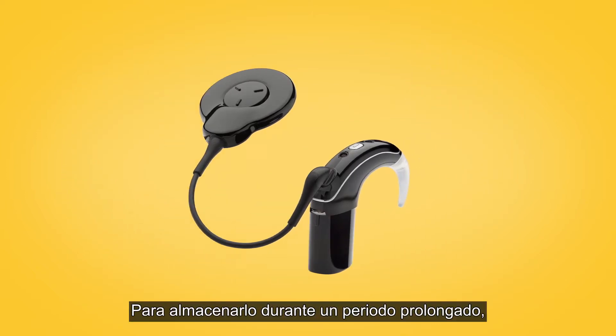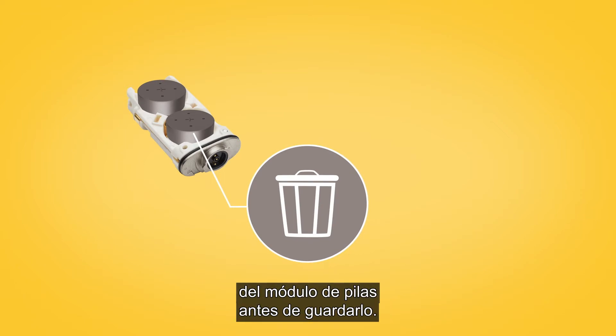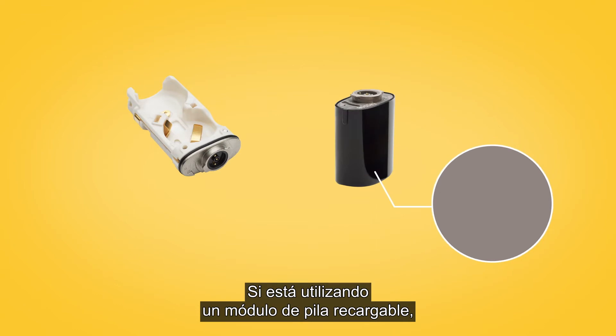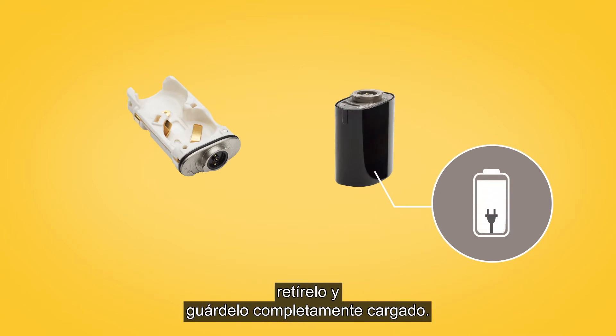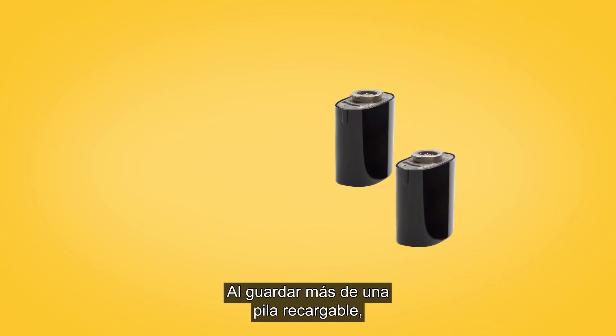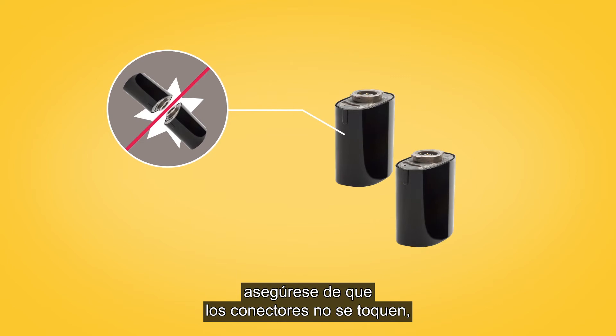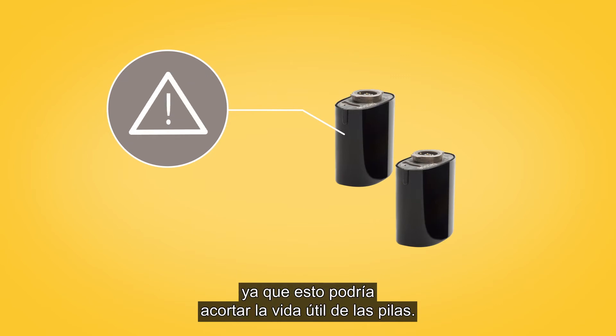For long term storage, you should remove disposable batteries from the battery module before storage. If you are using a rechargeable battery module, remove it and store fully charged. When storing more than one rechargeable battery, be sure the connectors do not touch, as this could short the batteries.